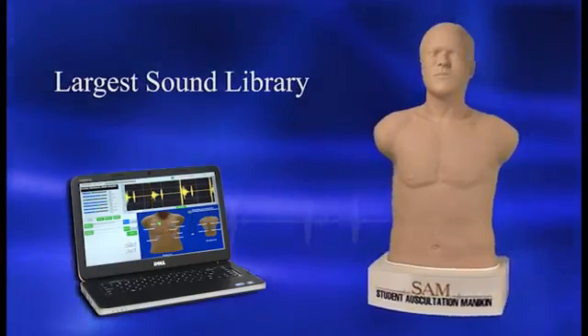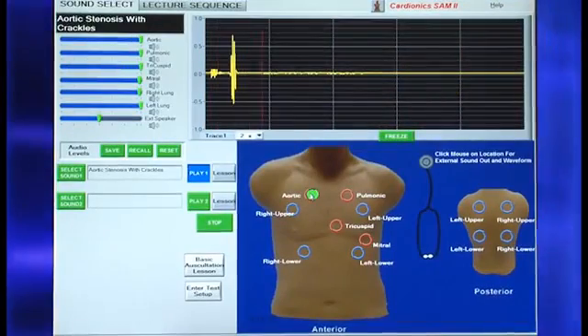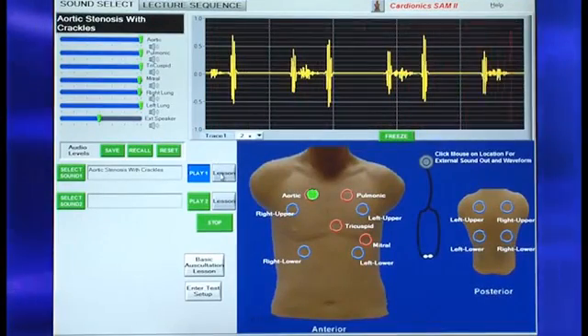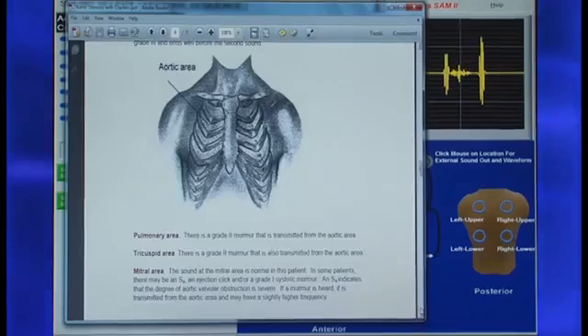With the largest sound library available in a student mannequin, SAM-2 includes phonocardiograms, sounds displayed at correct anatomical sites, programmable and password-protected lessons, and much more.